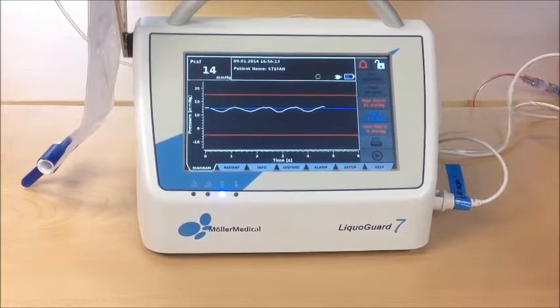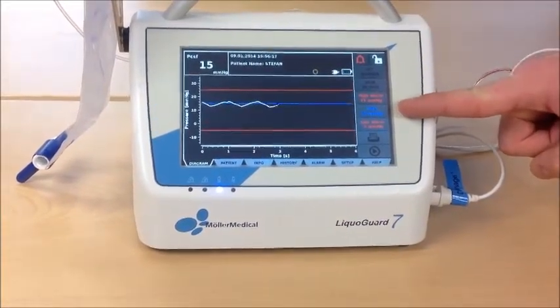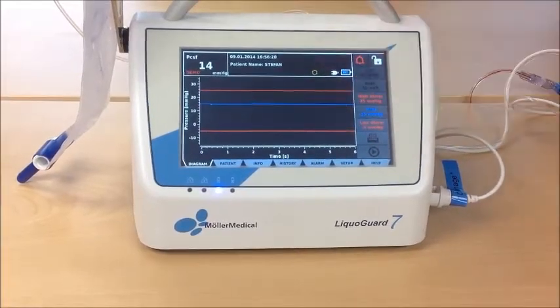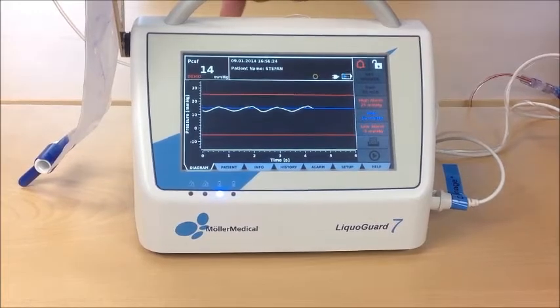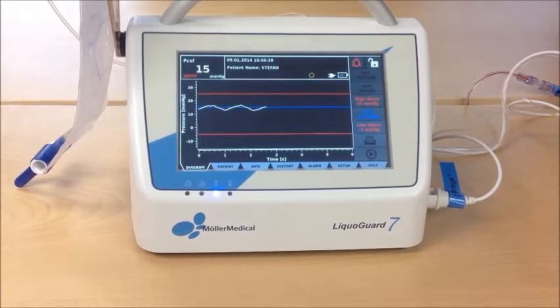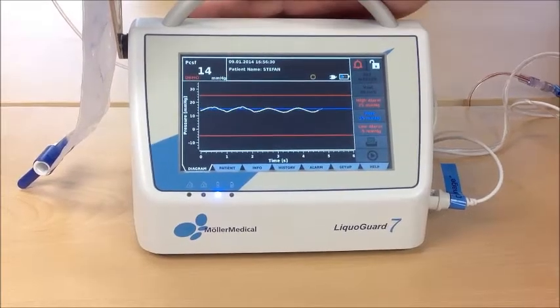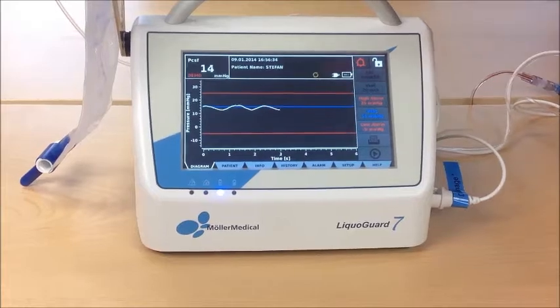In this situation, the patient shall have a pressure of 15 mmHg. Whenever the pressure is higher than the blue line, the LifoGuard will drain to reduce the pressure. Whenever the pressure is below the blue line, the pump will not turn. So drainage is controlled because of pressure.